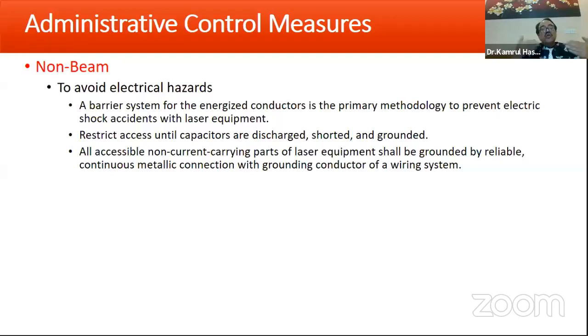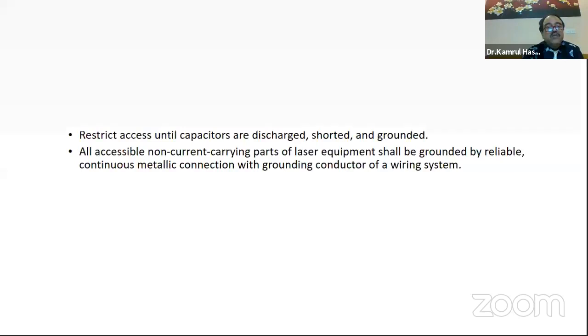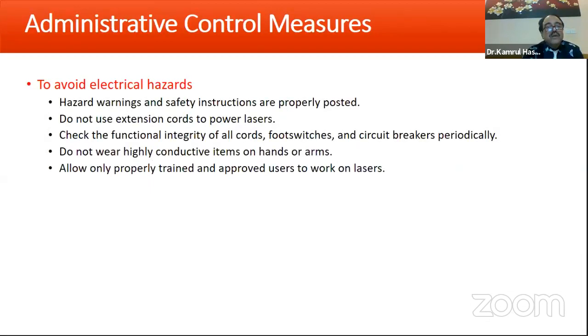You should not keep your hand near the laser beam when using a joystick. Avoid the fingers and other areas, even the sucker tube, because there is a chance of burning any area.